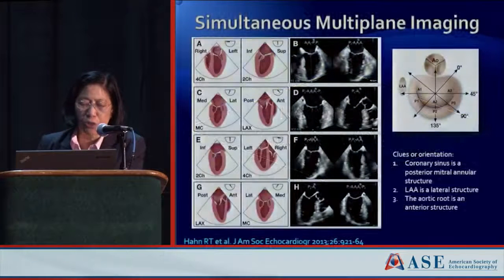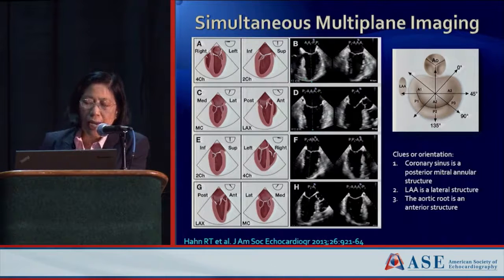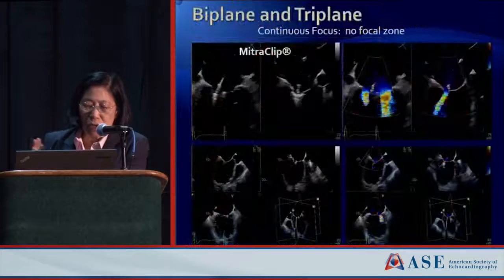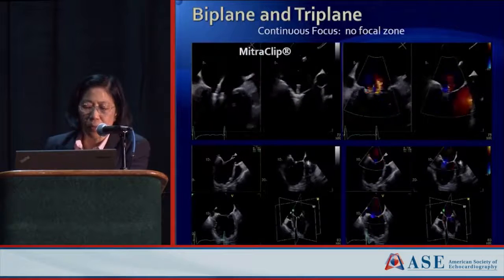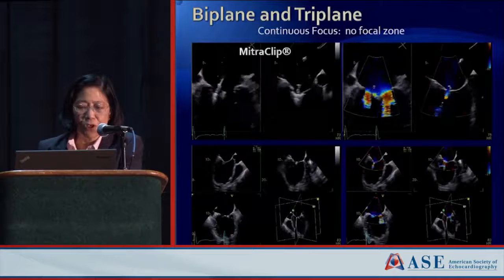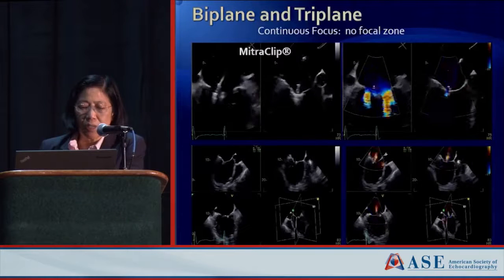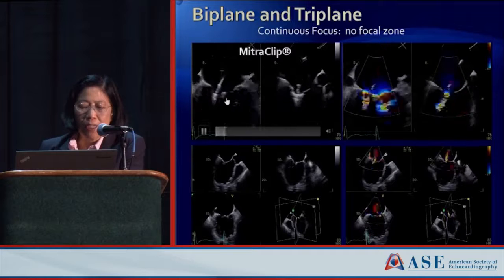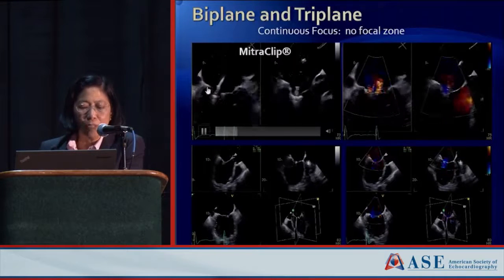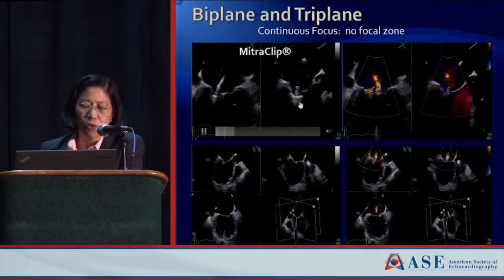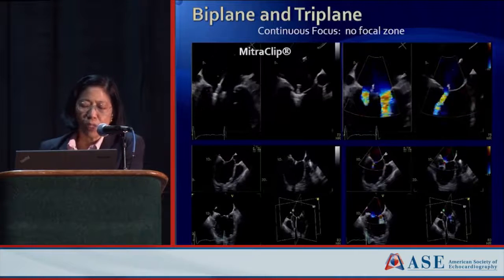For 3D imaging, we frequently use a simultaneous multi-plane image, and the secondary image defaults to being exactly orthogonal — 90 degrees — but you can vary it. The E95 also has the triplane mode, so you have not only biplane but a third plane. This is shown with a mitral clip — you can simultaneously see the location of your clip in the lateral-to-medial space as well as focus on the clip arms in the AP direction.